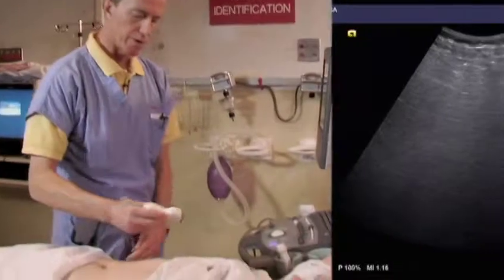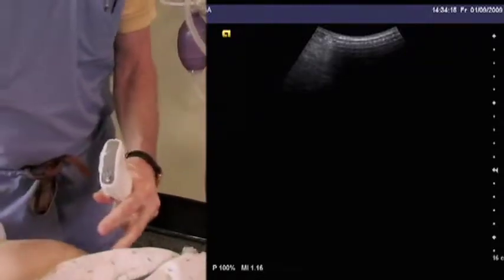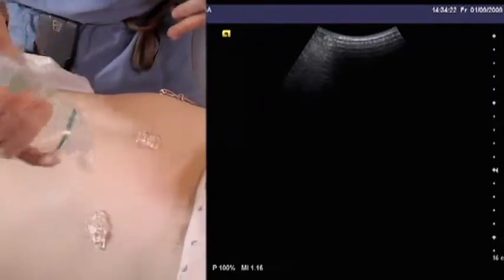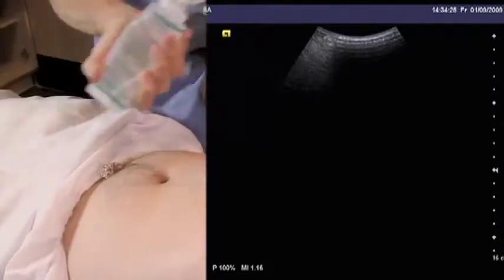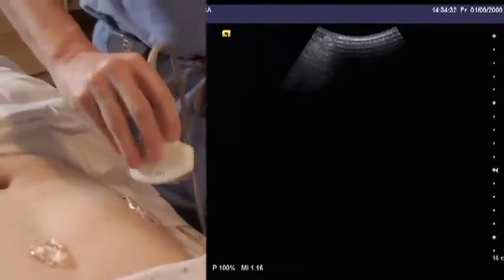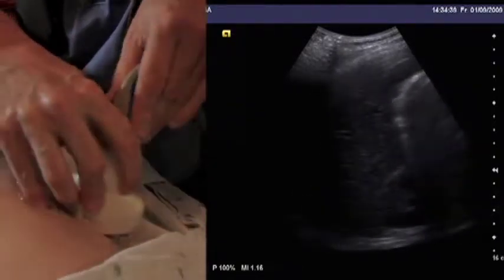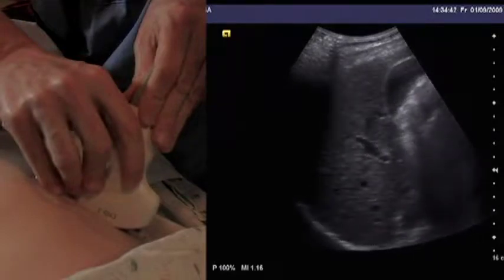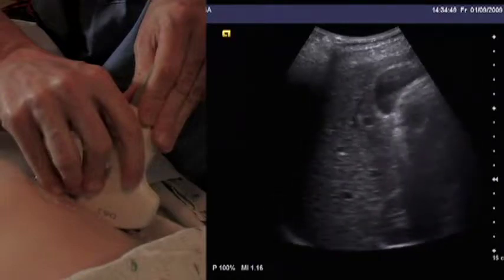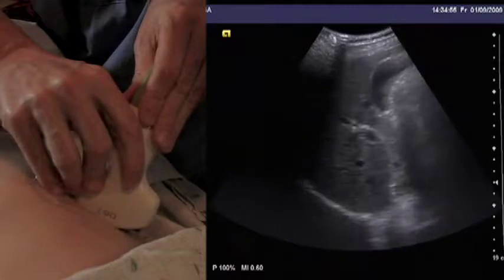In the right upper quadrant, most of the time we have to use the intercostal window. Since speed is important in the FAST exam, we usually apply ultrasound gel in each of the four locations we're going to be scanning prior to starting, so that we don't need to be concerned about that during the exam. I think it's sensible to do the entire exam in real time and then obtain images later. The intercostal window is parallel with the ribs, probe points to the head, same as the intercostal approach to the gallbladder. You usually need quite a lot of depth and adequate gain to see the deeper structures.